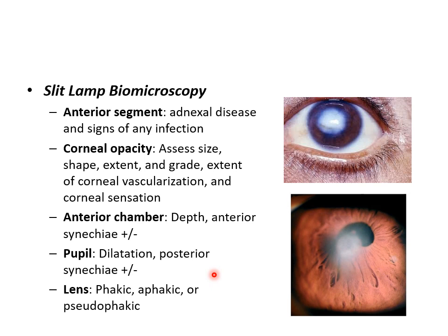Look at the anterior chamber, look at the depth of the anterior chamber, see if there are any anterior synechiae. Now, the cases that have anterior synechia have a slightly different surgical approach. These synechiae have to be broken, and you have to know that there is a synechia over there, because when you are dissecting off the recipient cornea, before putting the donor cornea, you have to be careful, because it will obviously make dissection slightly difficult at that particular site. So you have to know about pre-existing anterior synechia.